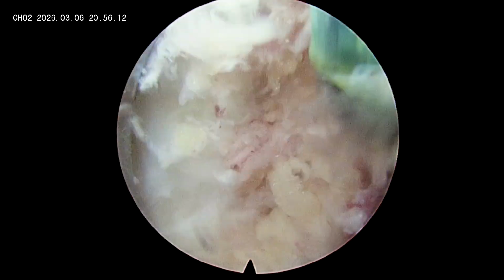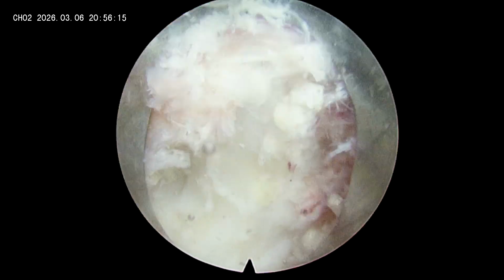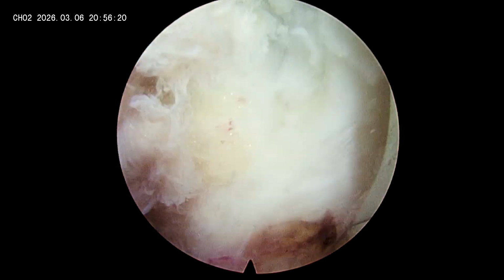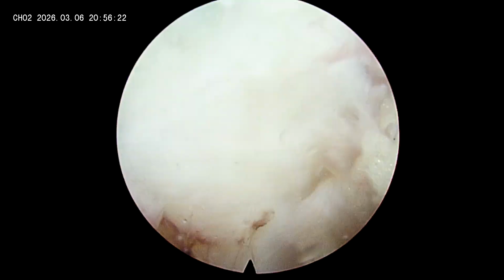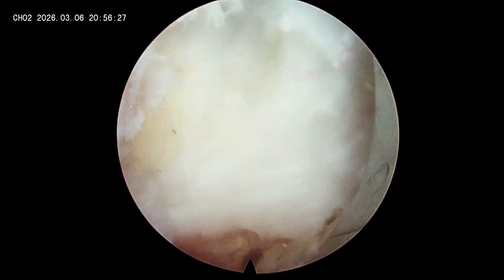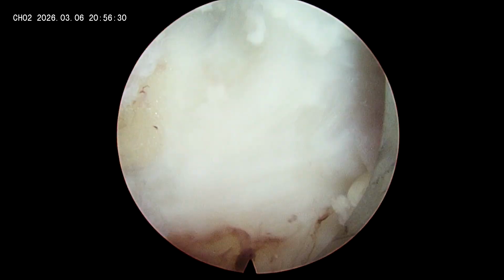Whenever you see bleeding, remember this is a very important point. Do not ignore this. Whenever you see any bleeder, try to coagulate it. If it takes 5 minutes, 10 minutes, nothing to worry about. But always try to coagulate the blood vessels right away whenever you see them.